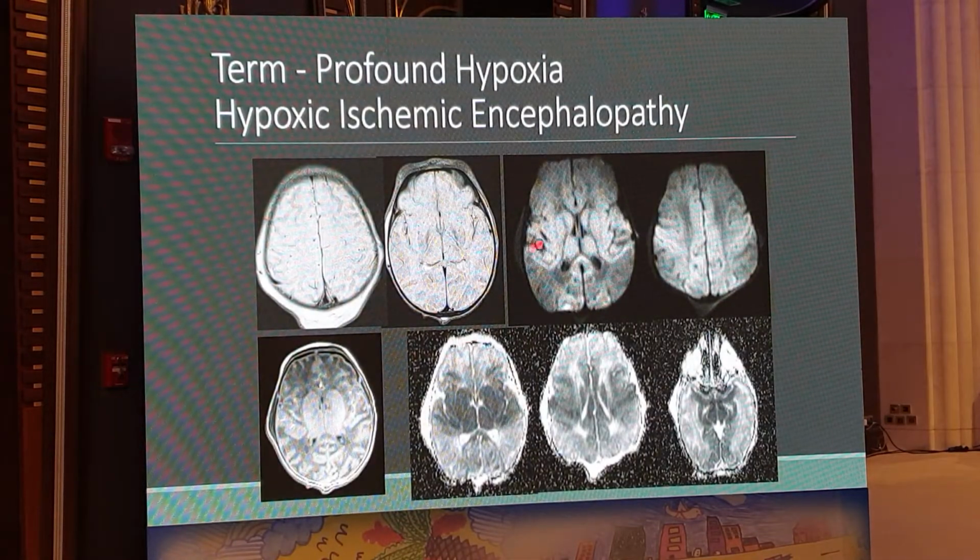Another patient with really devastating changes. These T2 weighted images show significant loss of the cortex-white matter interface with severe edema bilaterally, involving the bilateral hemisphere parenchyma, the thalami and the basal ganglia.